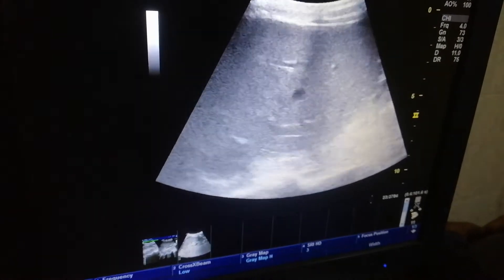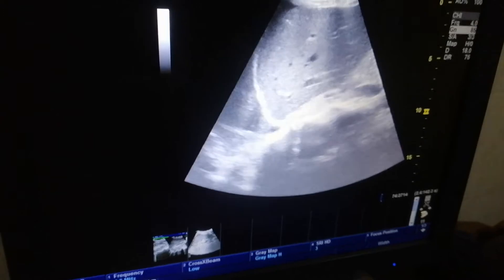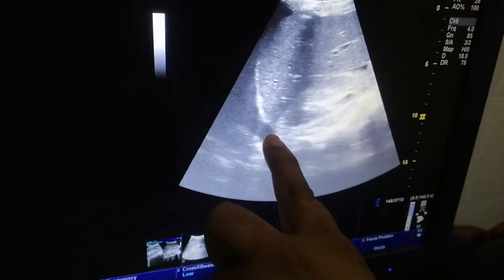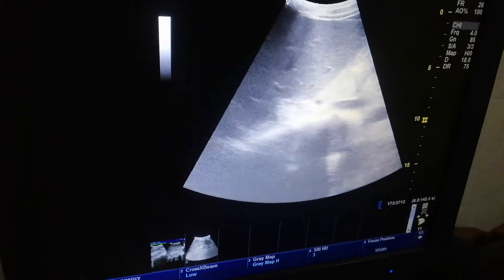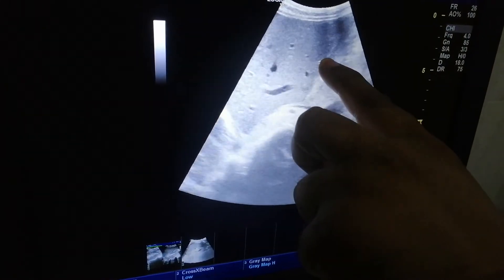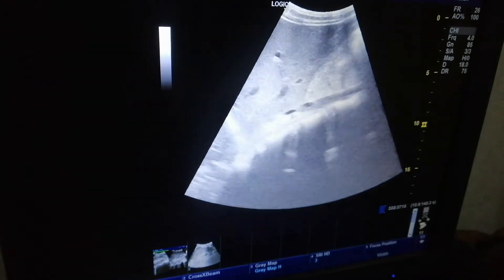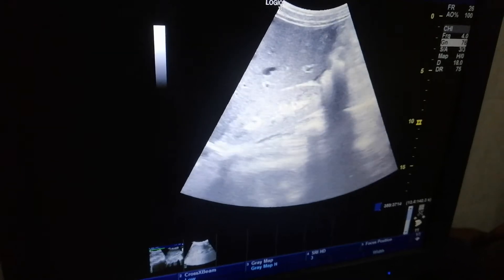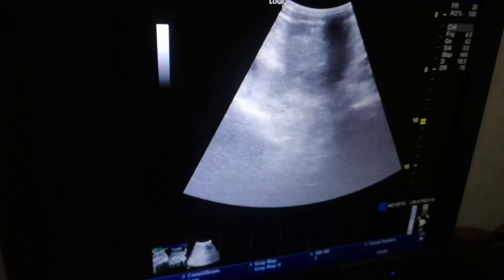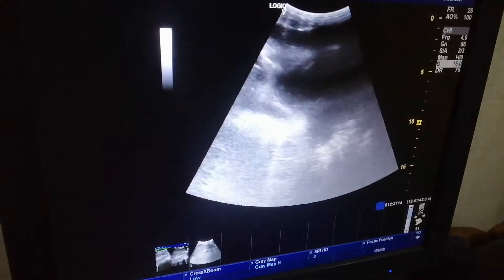There is mild pleural effusion on the right side. Typical appearance of the gallbladder — thick wall, edematous. The kidneys are also echogenic. There is moderate ascites.